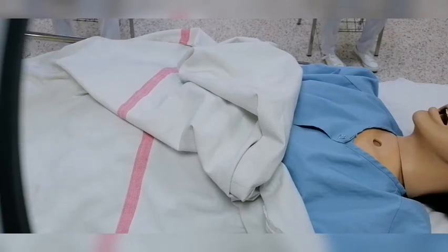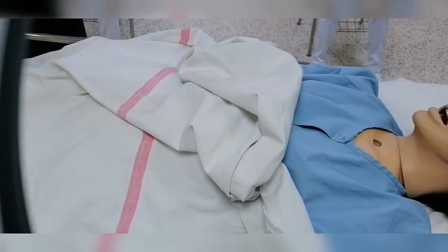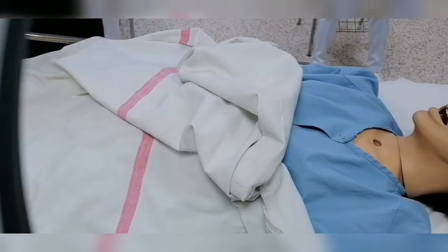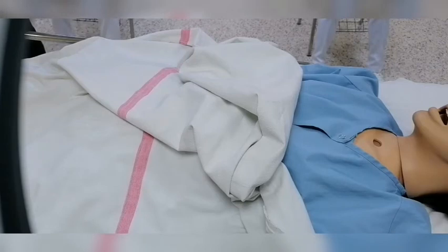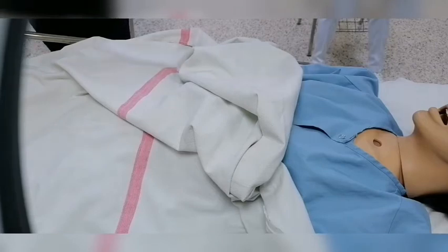Is it okay? So for any procedure, before doing that, you will either verify it from the client chart, or you will assess the need of the procedure according to your assessment of your patient. So those are the basic steps for any procedure. You have to verify the need for the procedure. You have to then prepare your equipment for the certain procedure. So for the dressing, we have to prepare the dressing set.